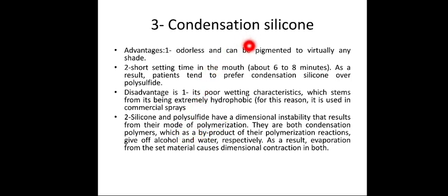Also, condensation silicone releases a byproduct in its polymerization reaction, which is alcohol, a volatile vapor. When it evaporates from the impression material, it shrinks and gives dimensional contraction.